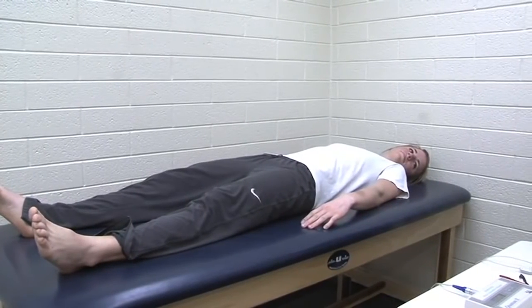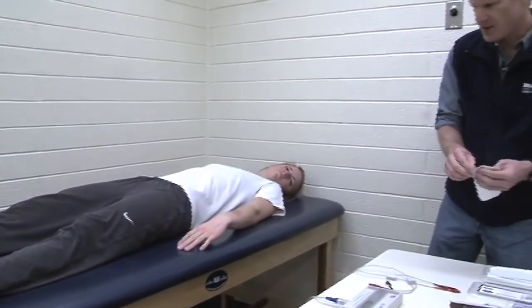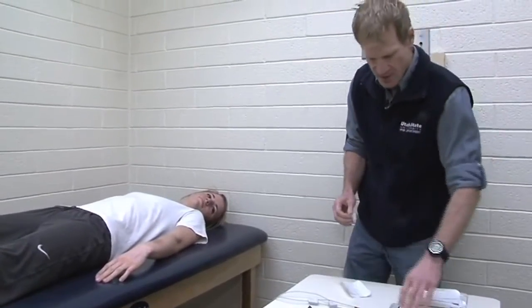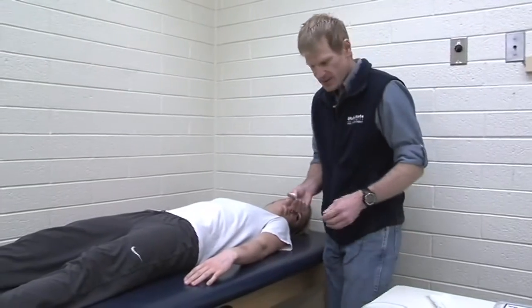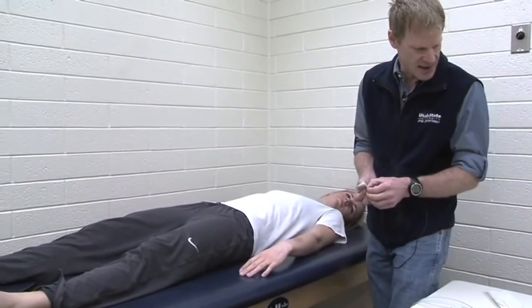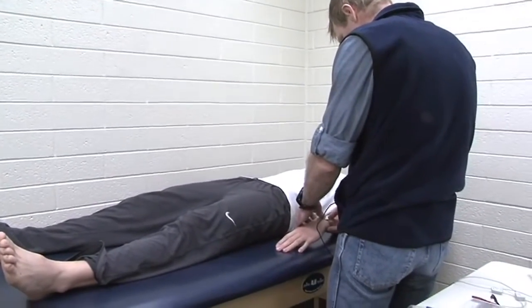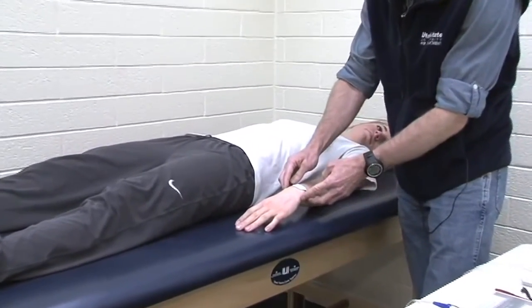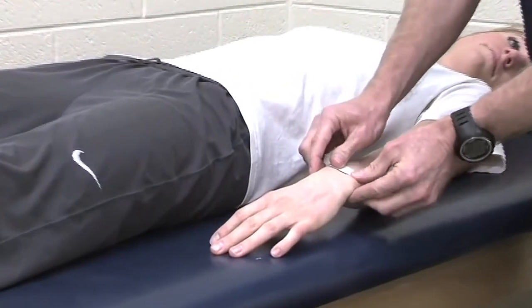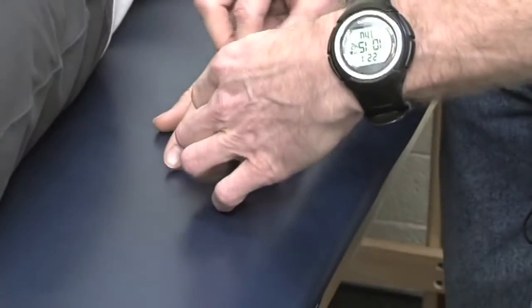This is a relatively easy procedure — it's not difficult for the client or the examiner, so that's probably one of the benefits of this method. However, despite the fact that it's an easy procedure, you still have to be very precise on your landmarks in order to get an accurate reading. I'm using some anatomical landmarks here, bisecting the styloid processes of the radius, and this one goes down on the proximal phalanx of the middle finger.